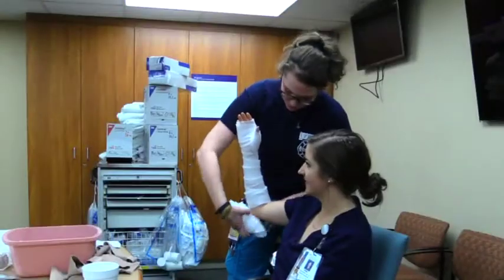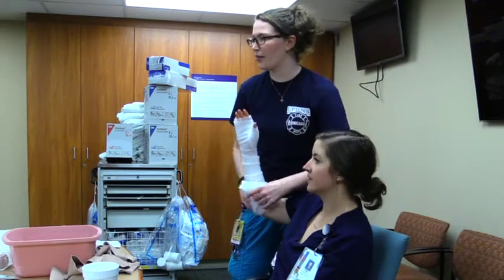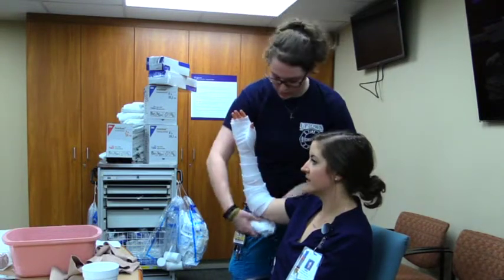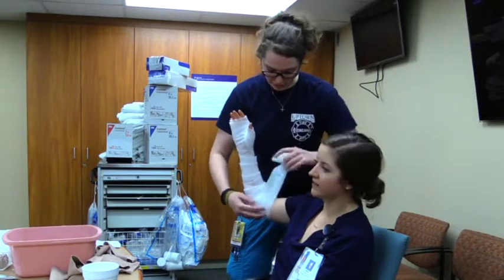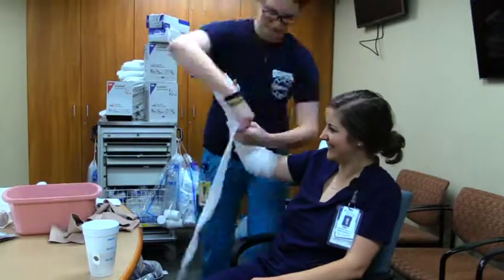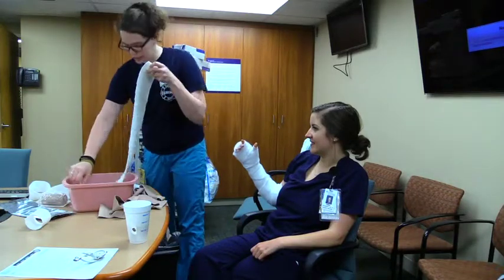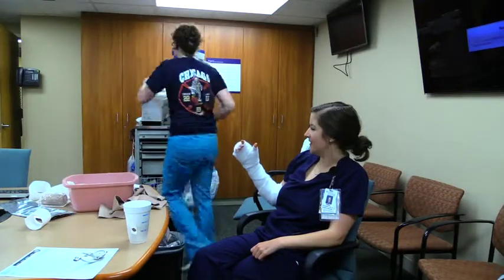It's really important at the joints that you're getting enough padding there, because as the patient bends and moves it's going to slip. Okay, so everyone's wrapped — you would dunk your sugar tongs.